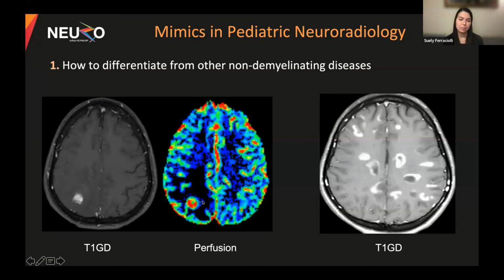And if we see in perfusion, it had high perfusion because it was a high-grade glioma. And when you look at the demyelinating disease, in this case an MS case, you see this pattern of enhancement with open ring enhancement. This tells us a lot about this. So if you see an open ring, especially when it goes from the inside.